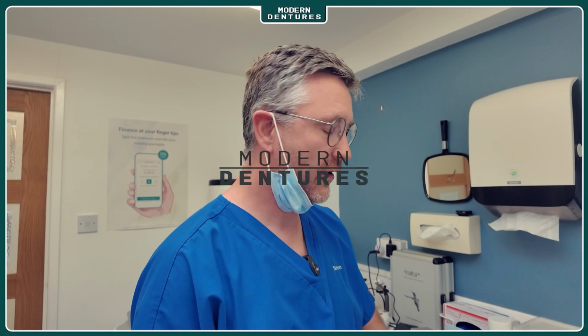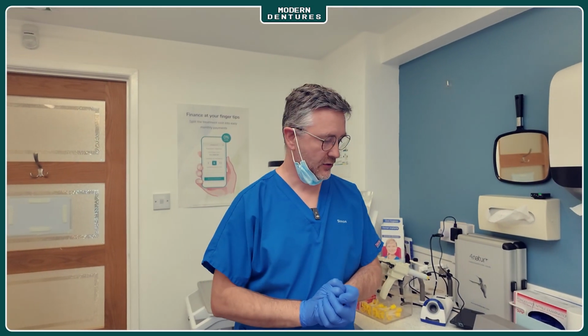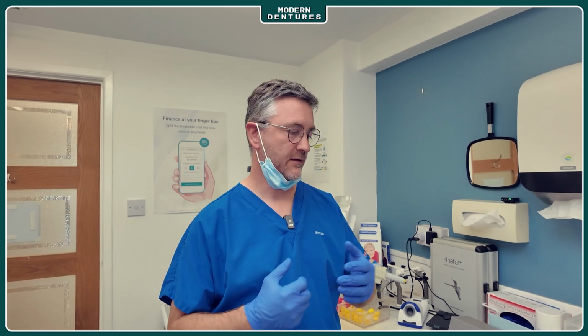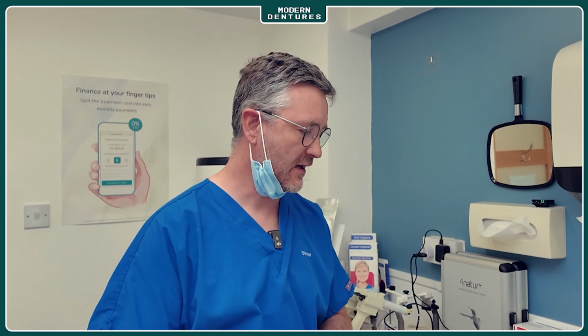Hello, in this video I'm going to be taking some alginate impressions for a lower denture. We're going to be making a new lower denture to go against some existing teeth and an upper denture. The upper denture isn't very old, so it's fine in this situation to make a new lower denture to the upper denture.